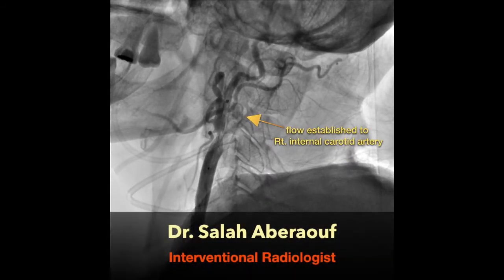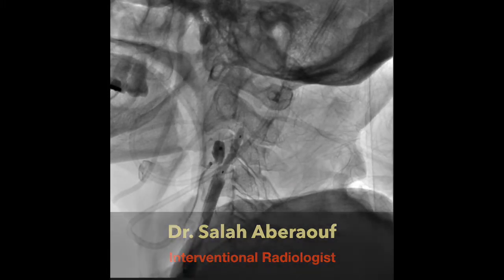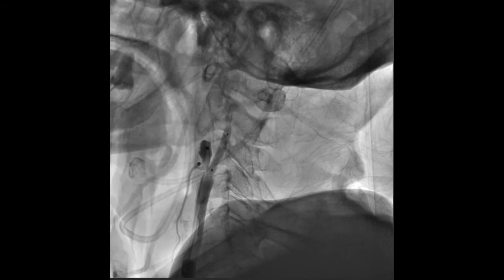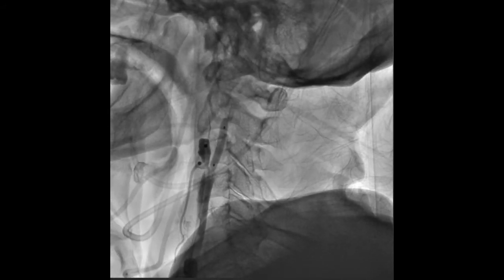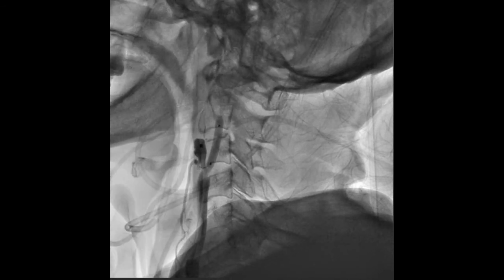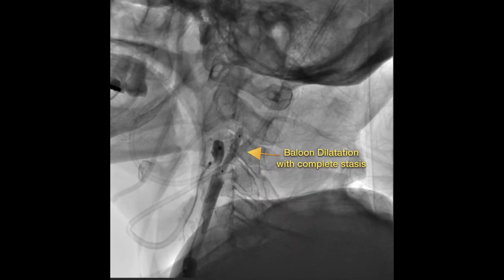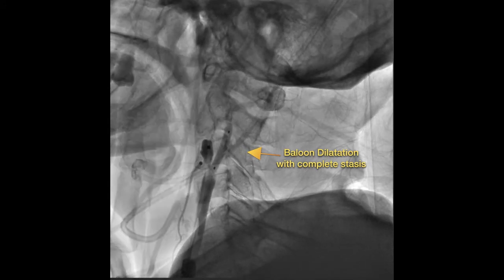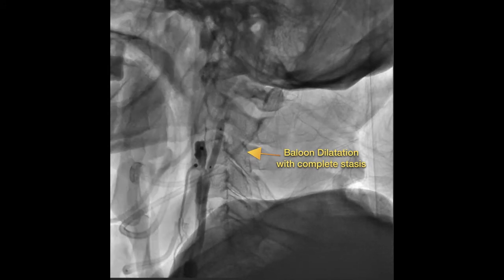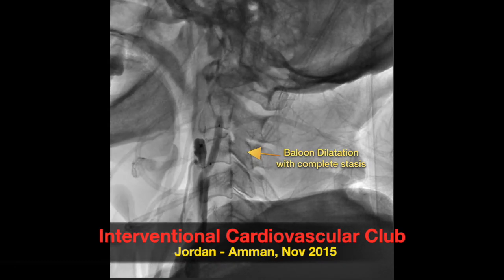I did serial angioplasties, then I sucked the thrombus. I kept on sucking the thrombus from time to time. Then I planned to insert and deploy a stent. I chose a conical shape stent, 9 mm at the common carotid, while 7 mm into the internal carotid.